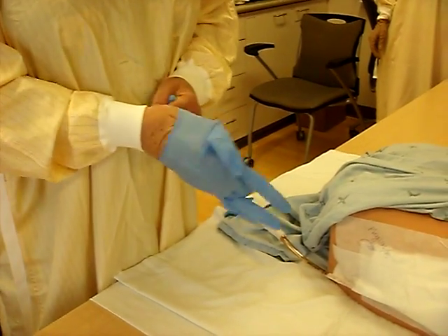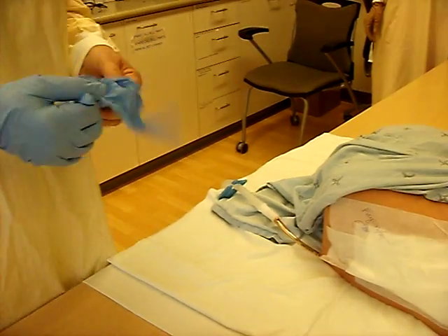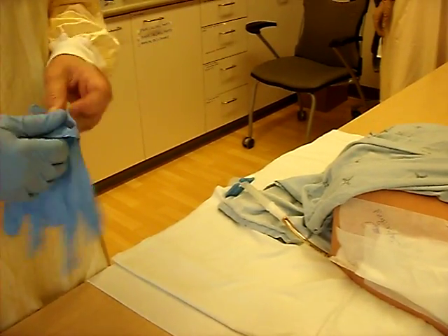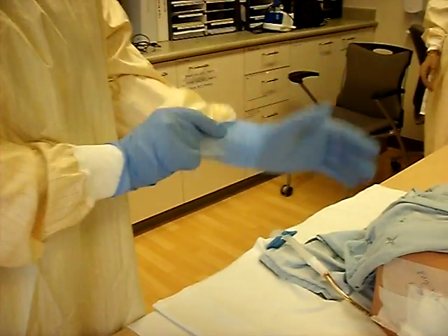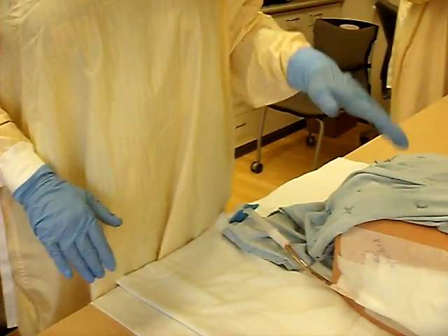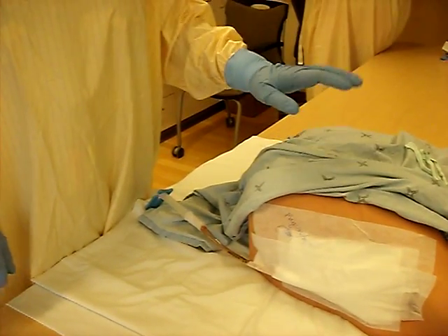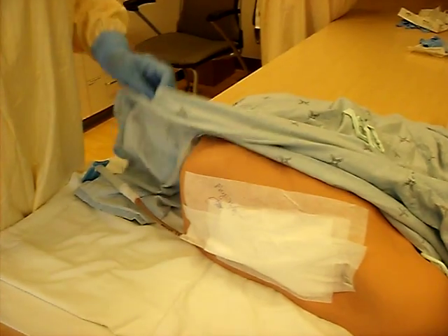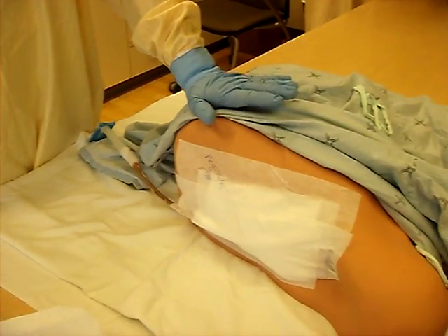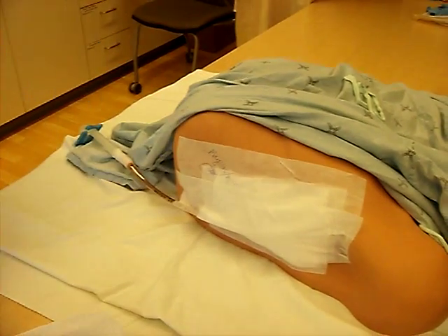I think only once have I pulled the chest tube where the patient could not cooperate, and that requires the timing of a circus acrobat. And sometimes that happens. So you really have to look at when the patient's breathing and time your removal. Hopefully you'll never be put in that position, but please be aware that it will happen on some patients, maybe who are palliative and the chest tube is not going to give them any more benefit. That was the reason it happened to me.